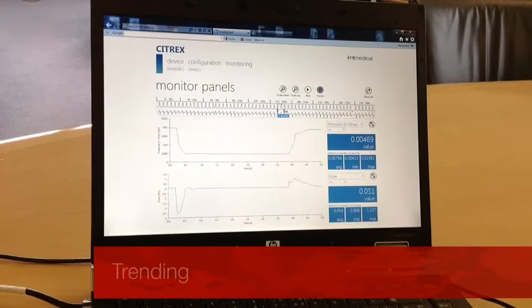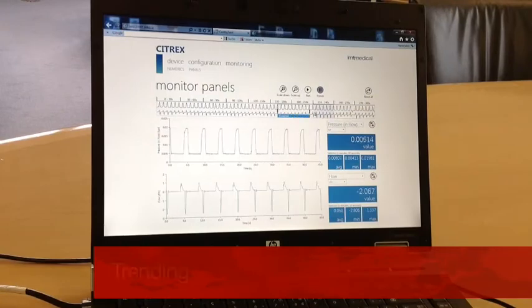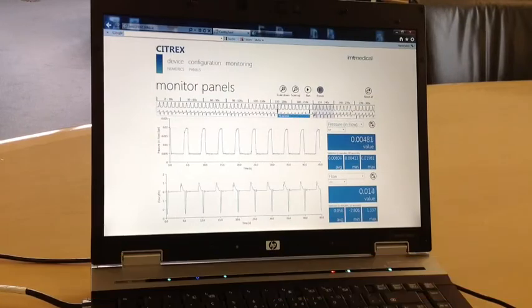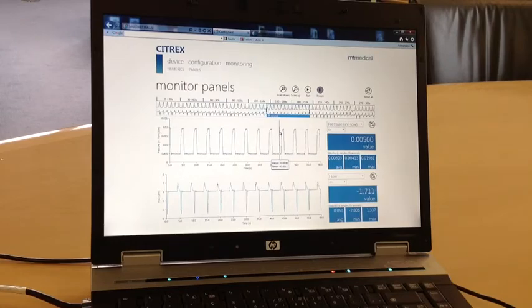Several minutes of trending gives you the ability to track data over a longer time. Select an area where you want to see more details and get it in the zoom chart.